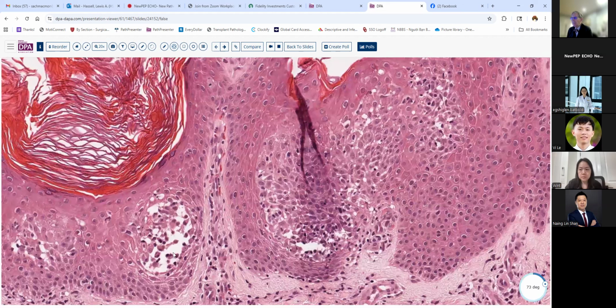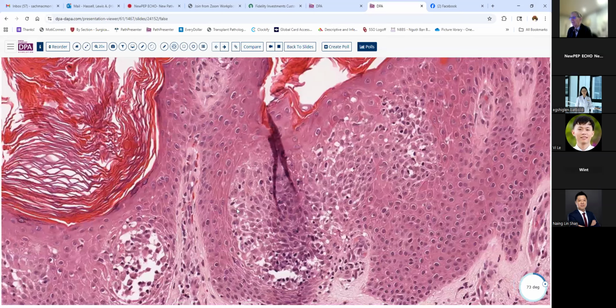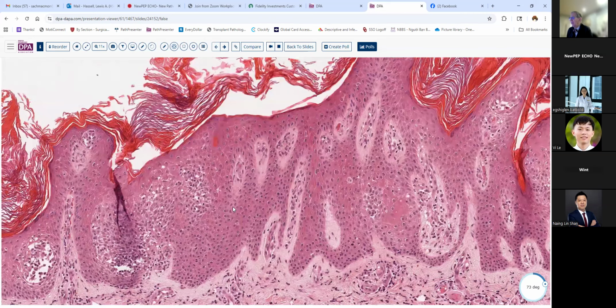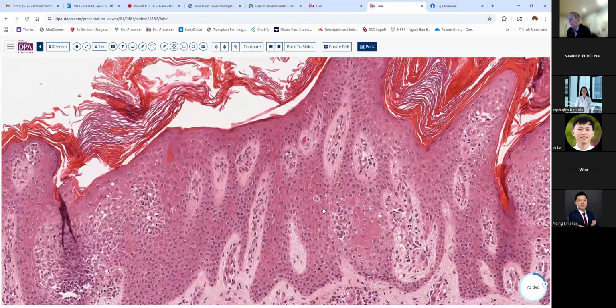These are what is sometimes called a clonal growth pattern, little clusters of cells, and these are not particularly different than the surrounding cells. There is a little bit of edema and discohesion, but sometimes this lesion, here's another one of them here. This is a lesion that can sometimes mimic melanoma because of this sort of clonal pattern of growth.